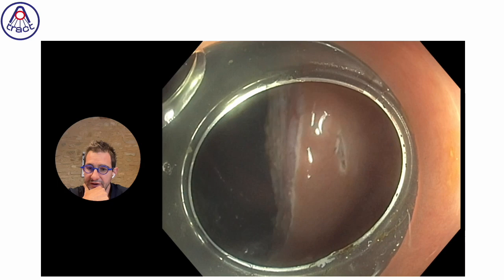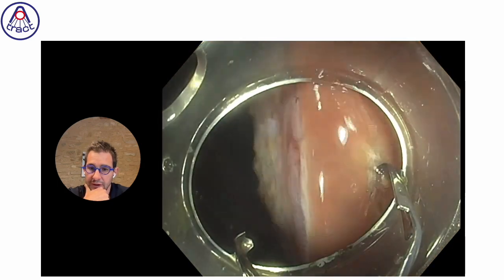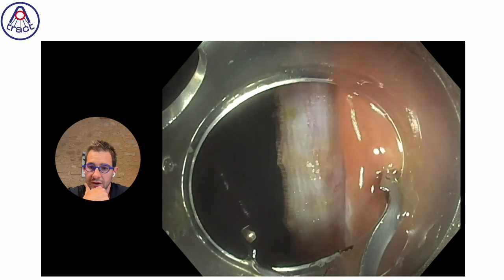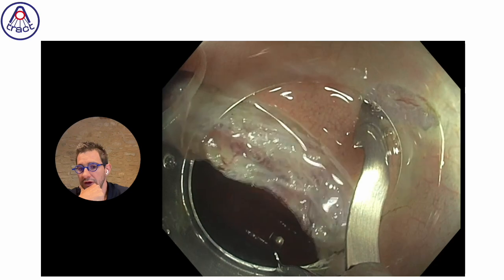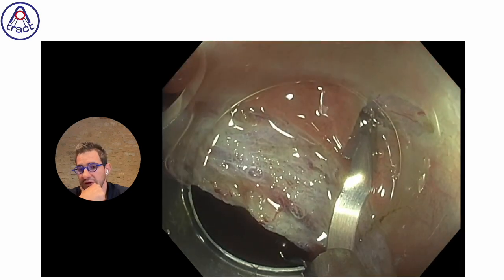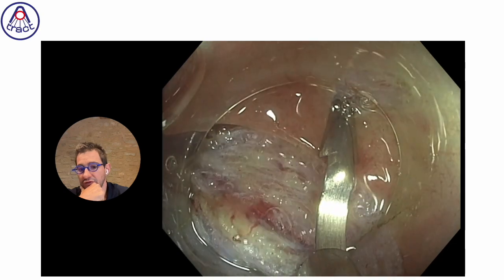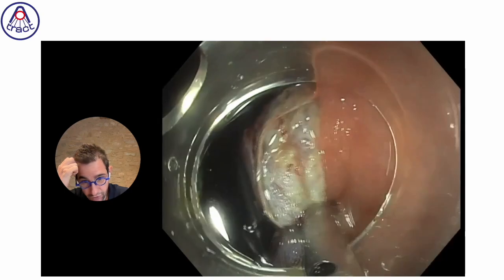So you will see here, once the incisions are done, we use the clip. We catch one of the small holes, and we try, if possible, to find a second one, but sometimes it's not needed. If you have one, you don't slip, and therefore you are able to close all the fold.